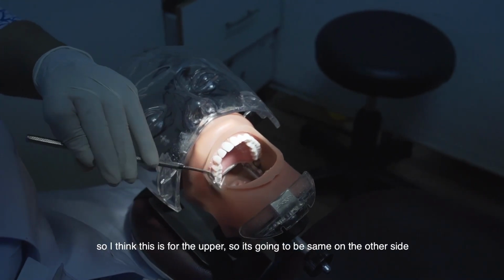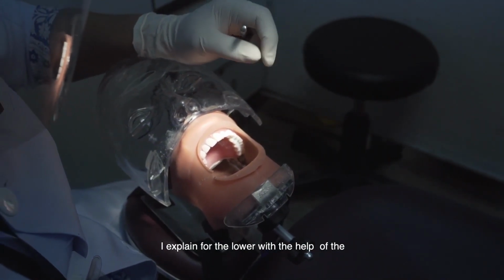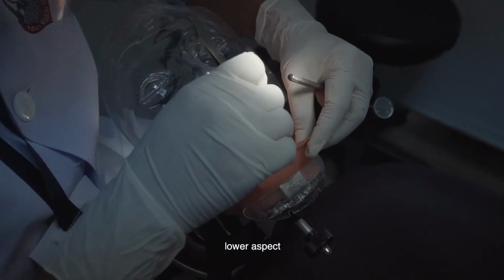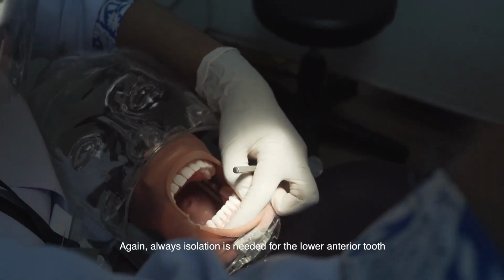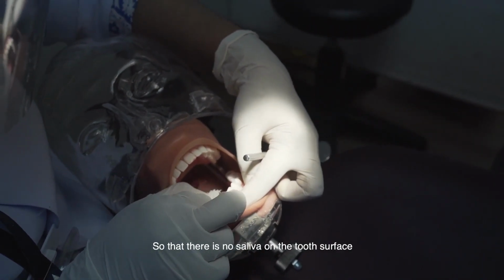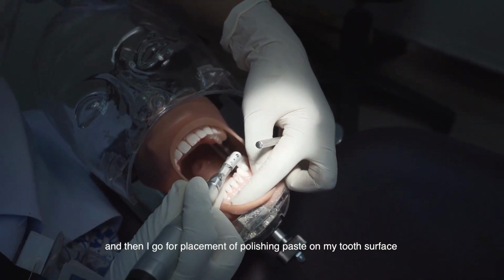Okay, so I think this is for the upper, and it's going to be the same on the other side. I'll explain it for the lower aspect. Again, isolation is always needed for the lower anteriors too. I dry the surface with the help of my gauze piece so that there is no saliva on the tooth surface, and then I place polishing paste on my tooth surface.